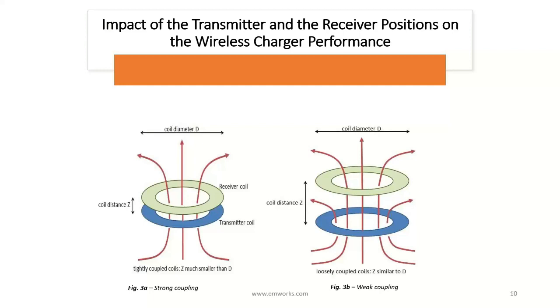So after having an idea about EMS for SOLIDWORKS, we can move on now to study our wireless charger system for a pacemaker. We are going to start by the impact, or to see the impact of the relative position of the charger coils. Both the transmitter and the receiver positions play an important role in the performance of any wireless power system, not only for this case, which is the implantable devices. It affects mainly the coupling coefficient, which also has a great impact on the receiver output voltage.